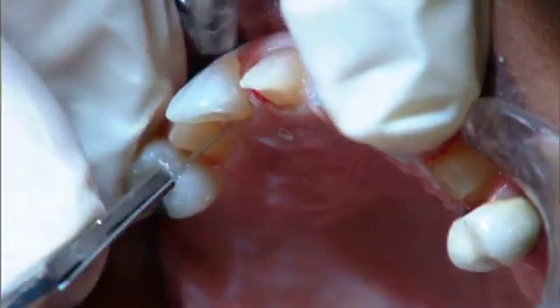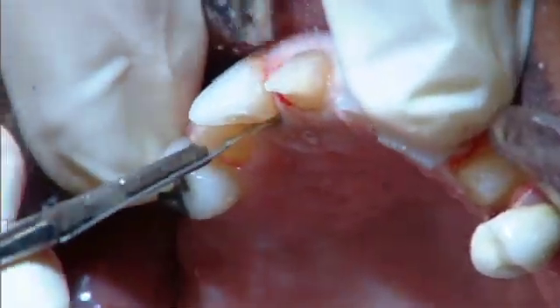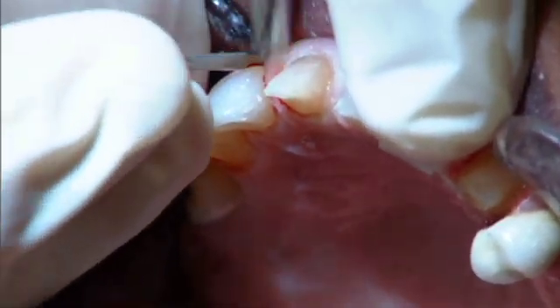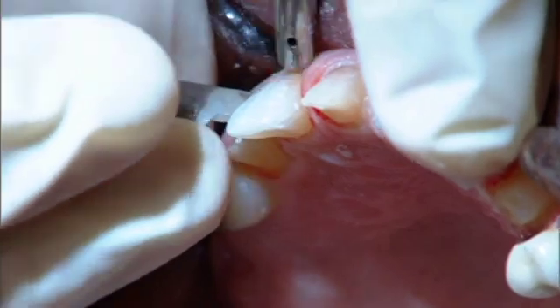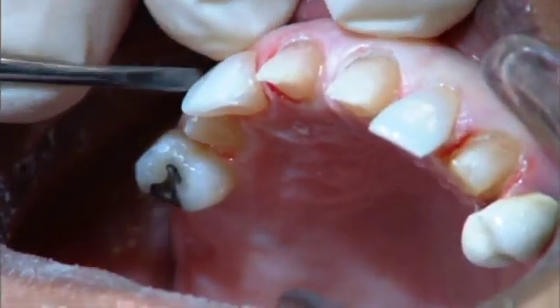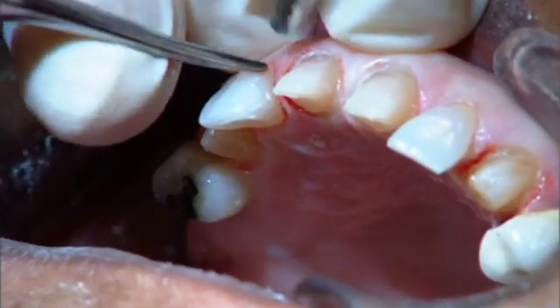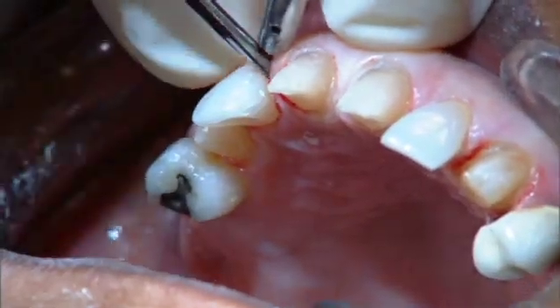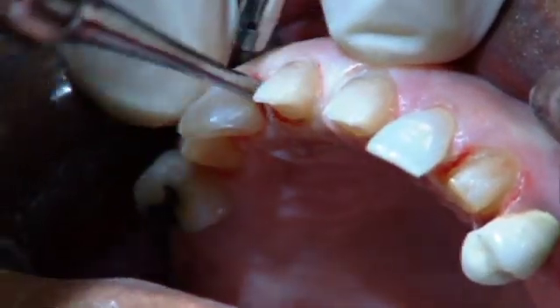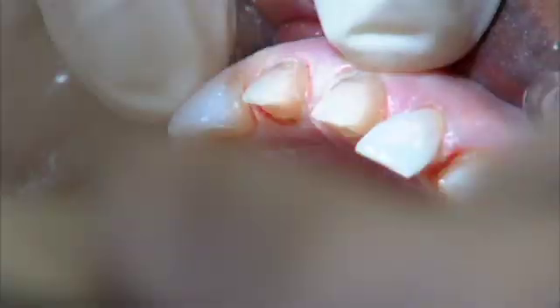What I want to be able to do, though, is preserve as much of the hard and soft tissue as I possibly can. So I'm going to take a little bit of time and try and preserve the buccal plate. We'll spend a lot of time elevating. Beverly and I have been through this with several teeth, haven't we? And she knows that if she feels anything, all she has to do is let me know and I'm going to stop.